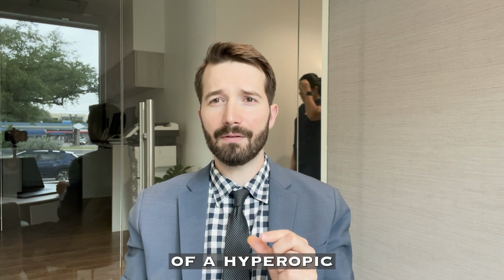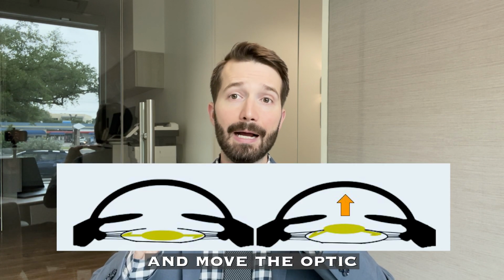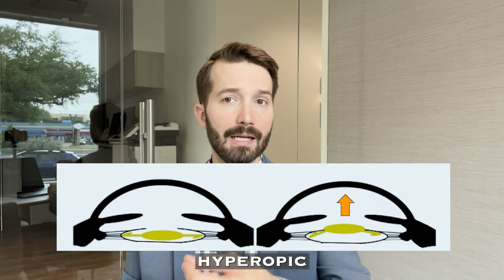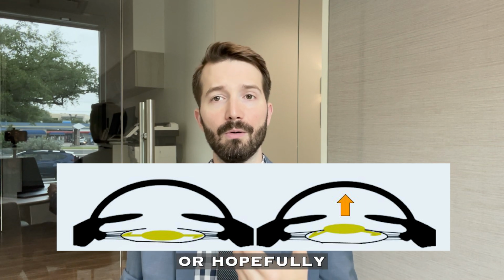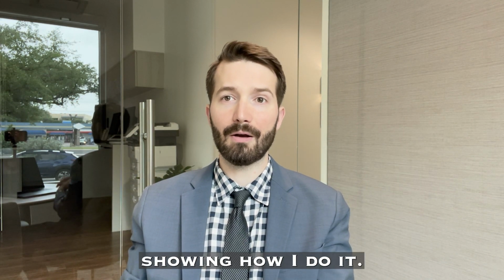She also had a little bit of a hyperopic prescription, which means she was a little plus on that eye. So if I can take the lens, which is currently in the bag, and move the optic or the circle part of the lens forward in the eye, I could correct two things at once. One, I can make her less hyperopic and help her see better in general. And two, I can reduce or hopefully eliminate her dysphotopsias by shifting the whole optical system forward. So I've created a little video for you here showing how I do it.